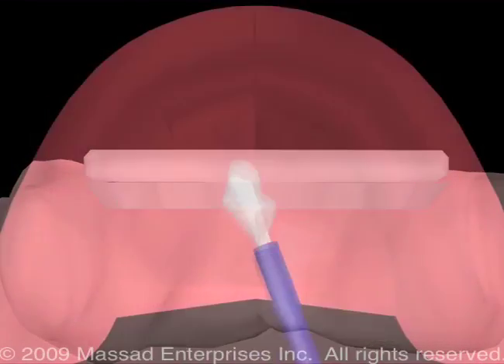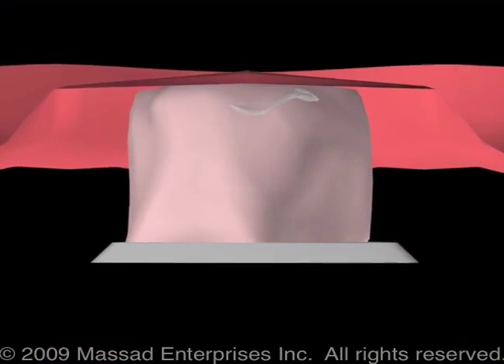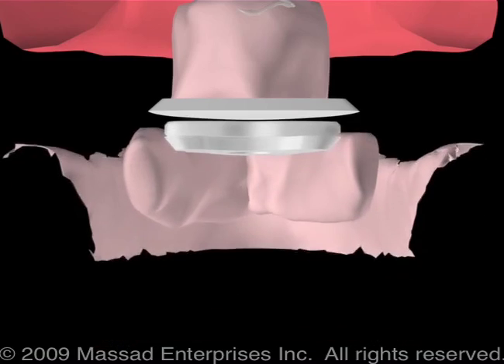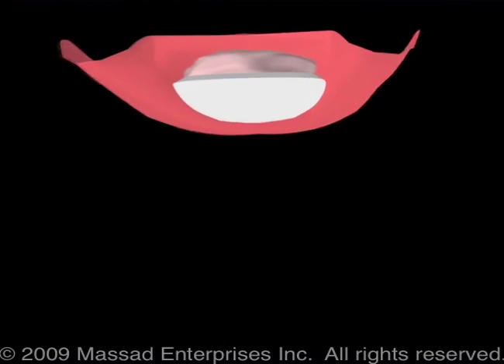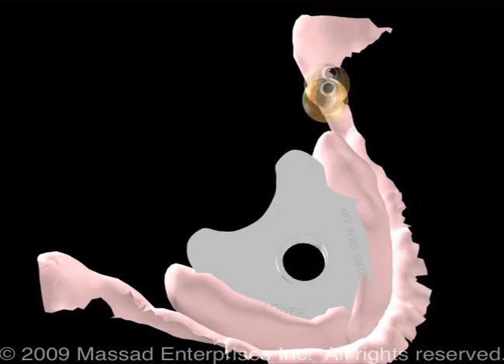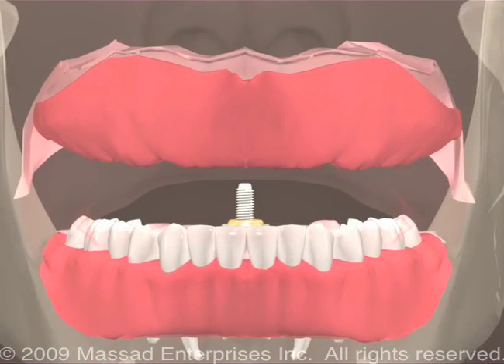Once the spacer is snapped into position, a bonding agent is cured on the palatal portion of the maxillary resin base to adhere the resin. Now apply light cured resin material on the palate, applying enough pressure to position the striking plate to be parallel with the pen receiver. Light polymerize until completely cured. Now remove the spacer. Once the spacer is removed, the nut and pin will then be inserted. This is then placed into the patient's mouth along with the maxillary base. At this point, the pen will be adjusted to the appropriate patient's occlusal vertical dimension.